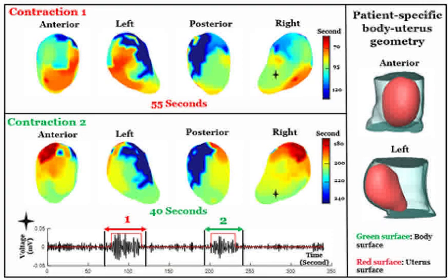News release. Tuesday, March 14, 2023. Tool has the potential to assist with preterm birth, labor management, and clinical decision making. Researchers funded by the National Institutes of Health have developed a new imaging tool called electromyometrial imaging (EMI) to create real-time, three-dimensional images and maps of contractions during labor. The non-invasive imaging technique generates new types of images and metrics that can help quantify contraction patterns, providing foundational knowledge to improve labor management, particularly for preterm birth.